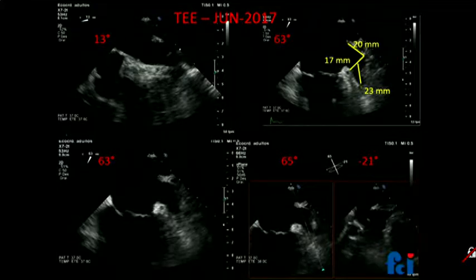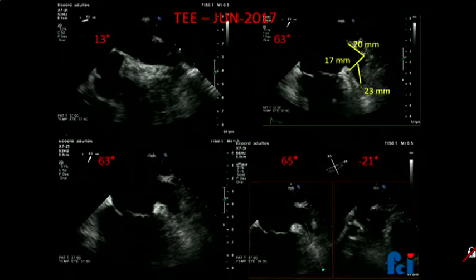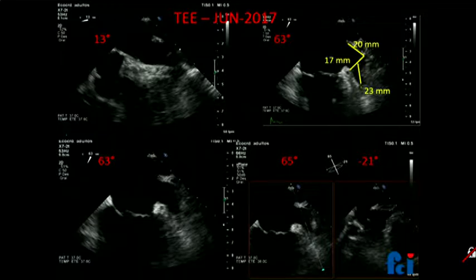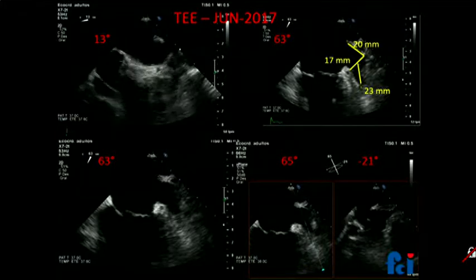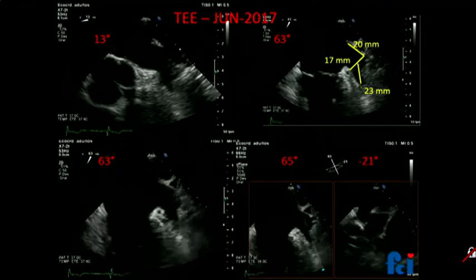How many of you are doing appendage closures? Almost half of the room. The standard view is not on a CT, but in order to determine the size of the device and whether the patient is a good candidate, we use this view. The distance is measured at the level of the mitral annulus where we have the circumflex artery — this is the mouth of the appendage. The depth of the appendage determines device sizing.